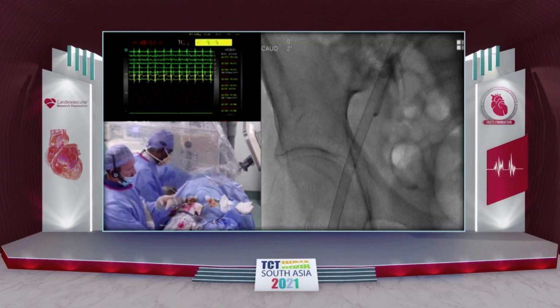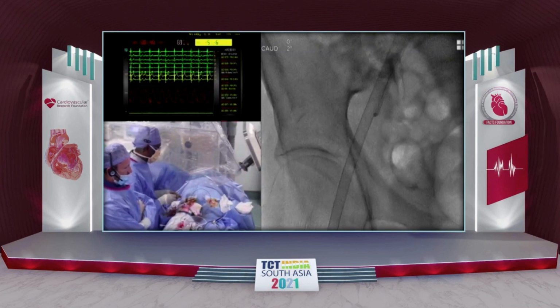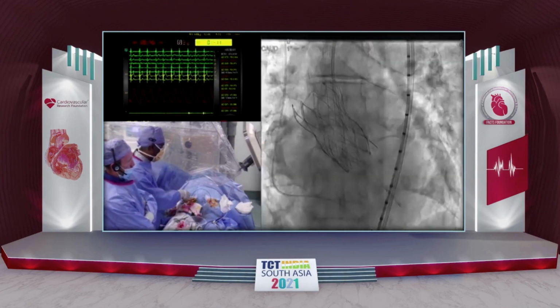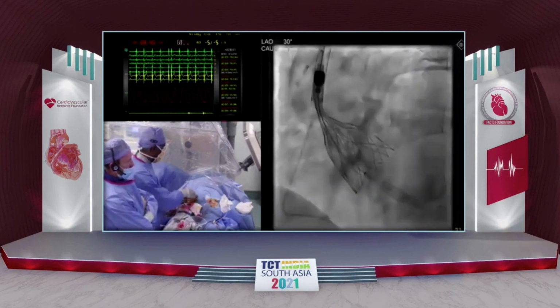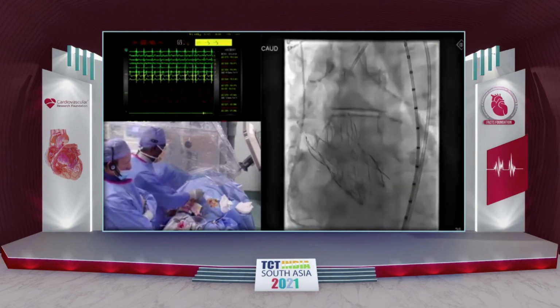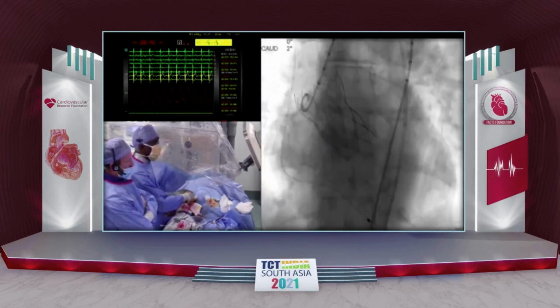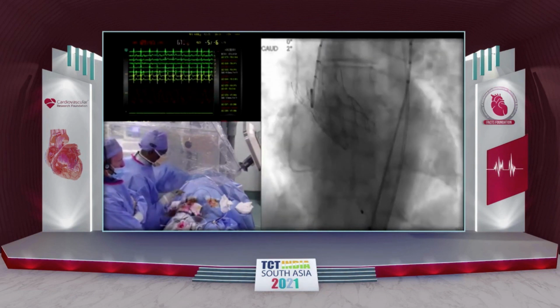And finally, the horizontal anatomy, that was the big thing today. Definitely horizontal anatomy, I feel it's superior compared to the Evolut. Yes, I think most of you saw, maybe we can go back to the final implant angiogram. You can see that the depth on the non-coronary and left coronary is similar in a patient with an angulation of almost 53 degrees. So you can see that it's really symmetrical depth of implantation, whichever way you look at it.